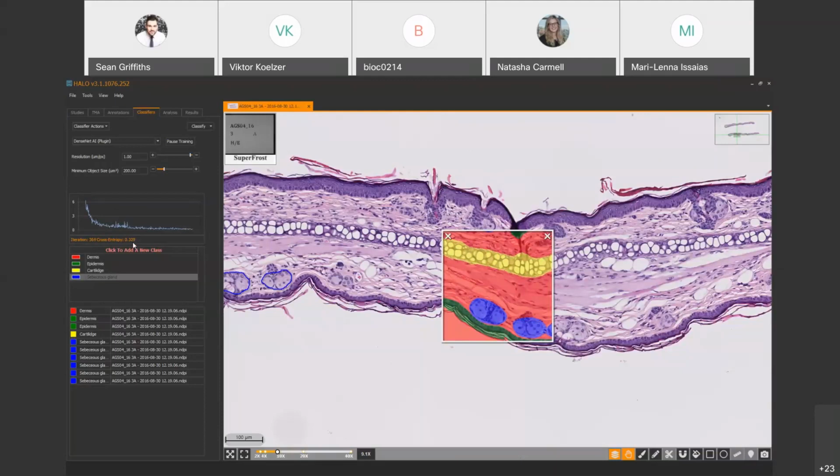We used to say with the VGG network that you wanted this cross-entropy to be below about 0.1. The new advice is more that you want it to stabilize at a lower figure. So obviously it doesn't have to be a particular number in mind, but as long as your cross-entropy, which is the difference between what we're seeing and what the system is seeing, stabilizes, then you know that it might be time to pause the training and run your analysis.